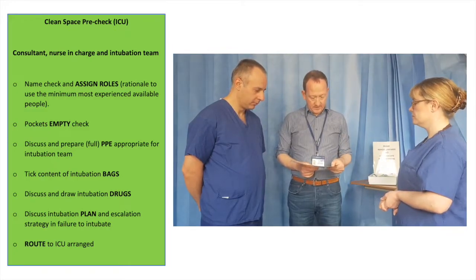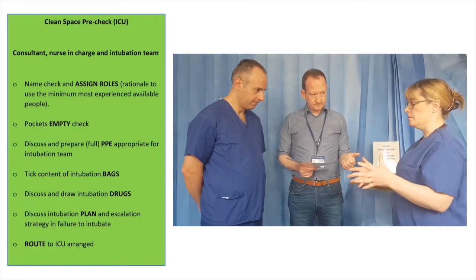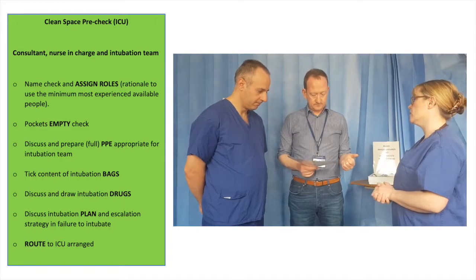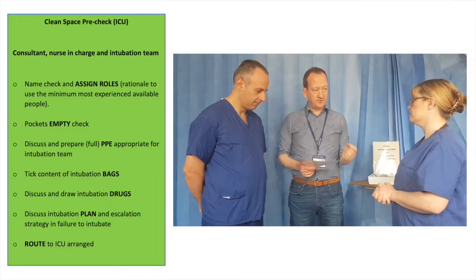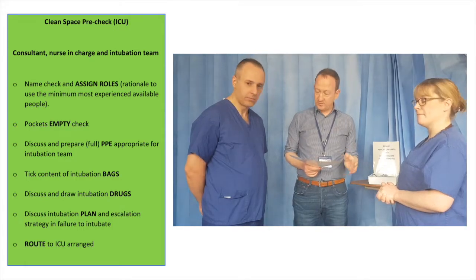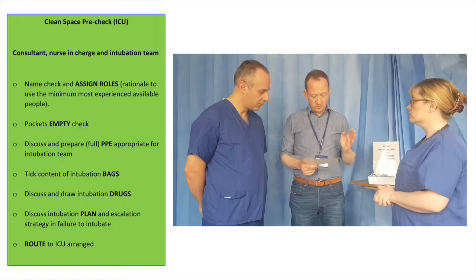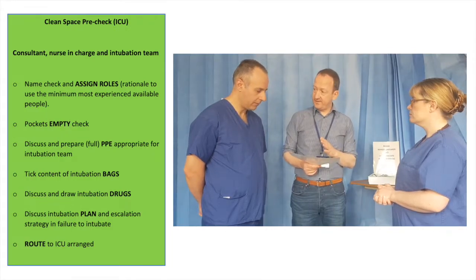Fantastic. Have we checked the intubation boxes? Yeah, so they have been all checked and tagged this morning, so we don't need to do a second check. And drugs were drawn up today, I did, yeah. I draw up the drugs I need for that patient and they're all labelled appropriately. Yes. Fantastic. So we've been through this simulation. We have an intubation plan and an escalation strategy. Yeah. Very clear about that.